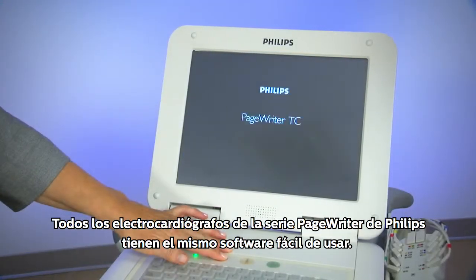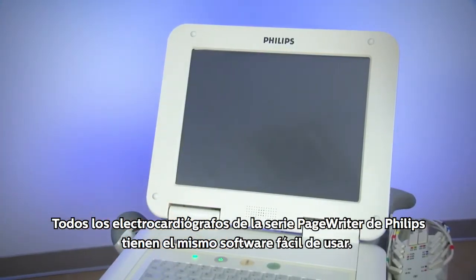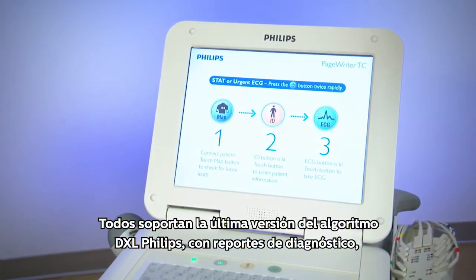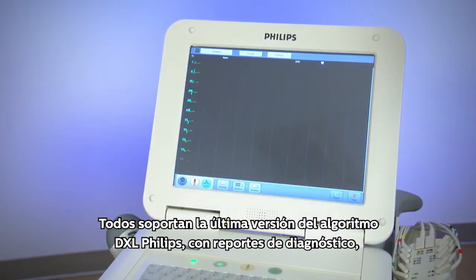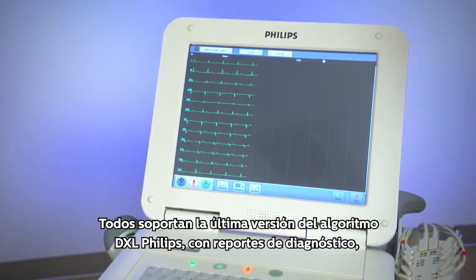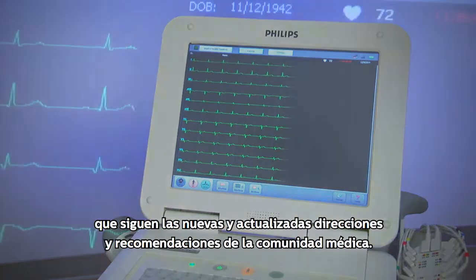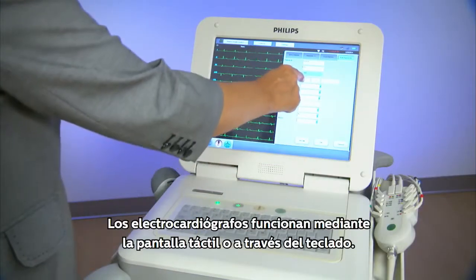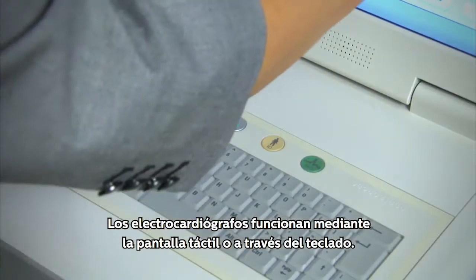The Philips PageWriter TC family of cardiographs all have the same easy-to-use software. All the cardiographs support the latest Philips DXL algorithm with diagnostic reports that follow newly updated guidance and recommendations from the medical community. The cardiographs are touch screen or hard key.